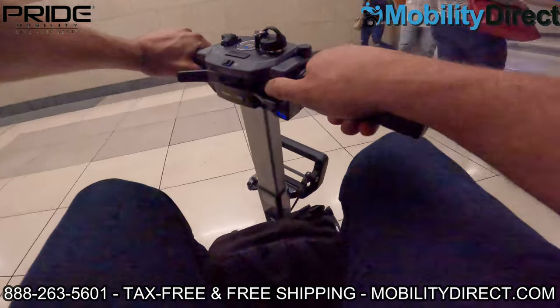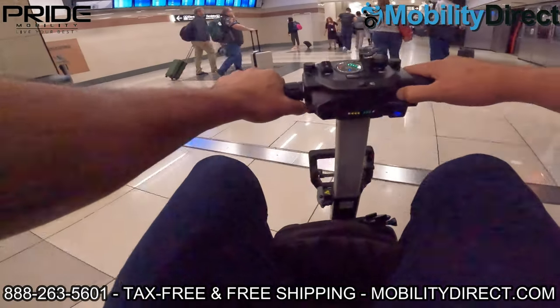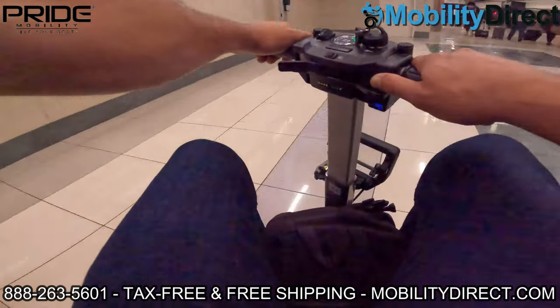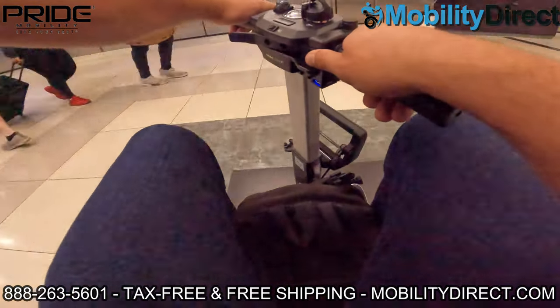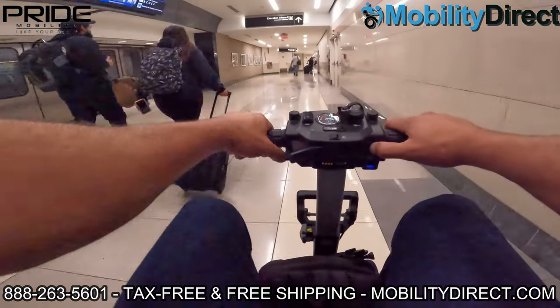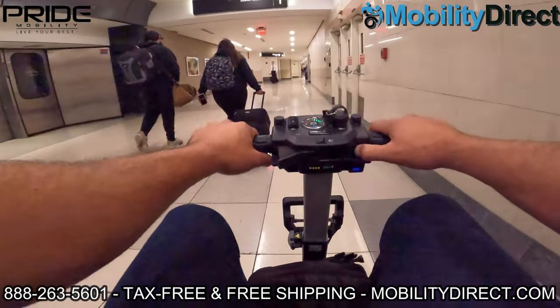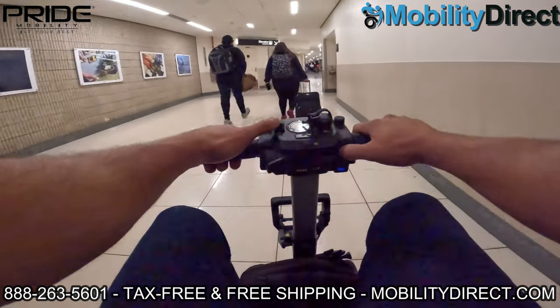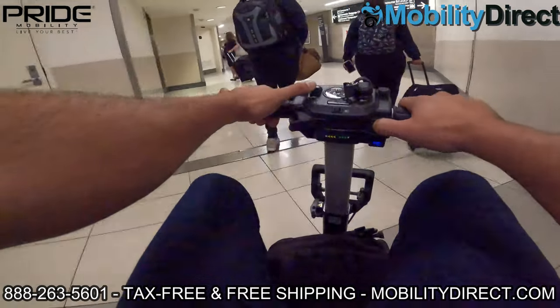Here we're showing you what it's like to go around the airport terminals. I'm looking for the elevator — this is in the Atlanta airport where I wasn't too familiar with getting around. I asked one of the attendants and followed the signs to the elevator, which would take me up to my gate, which was Gate A19 in the A section.